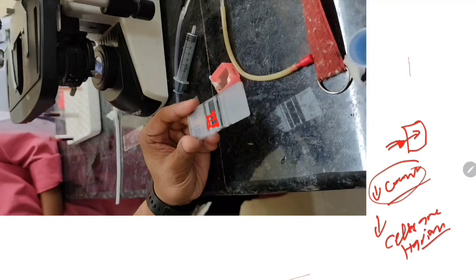Which cells? I am talking about the RBCs, which are heavier. If you put excess blood, fluid will come out from this counting area into the gutter. Here we have the side gutter, and because cells are heavier, with the fluid a larger number of cells will go down to the gutter, and you will be left with fewer cells on the platform itself.